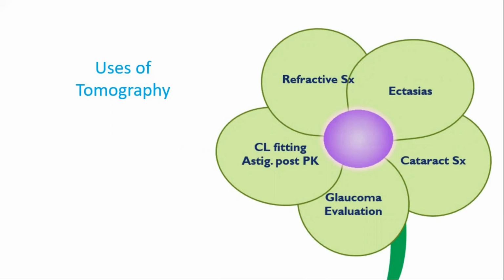And for glaucoma evaluation and contact lens fitting, and astigmatism correction after corneal transplantation.